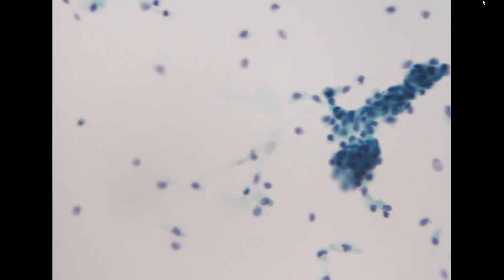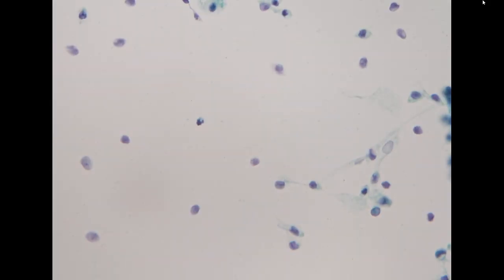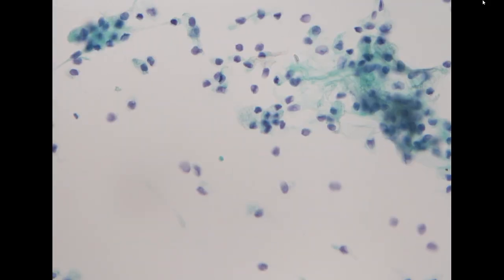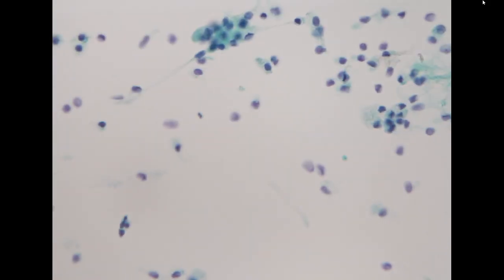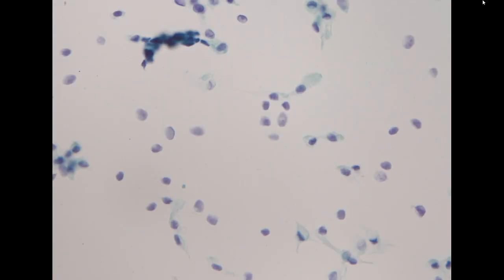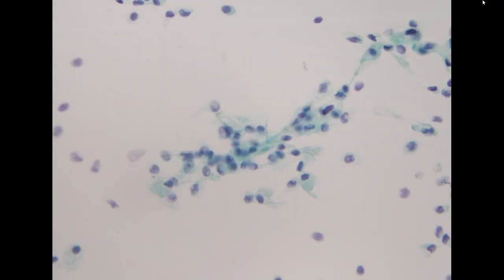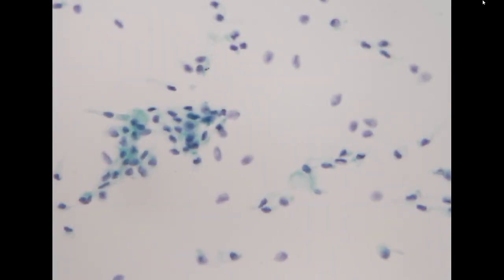However, in contrast to high-grade urothelial carcinoma, we didn't see more marked hyperchromasia, increased NC ratio, or coarse chromatin. We didn't see any of these. So this is actually a typical presentation of a low-grade urothelial neoplasm. In the current PARIS system, they emphasize identifying high-grade urothelial cells. So if you check the PARIS terminology, they would say negative for high-grade urothelial carcinoma, suspicious for high-grade urothelial carcinoma, positive for high-grade urothelial carcinoma.